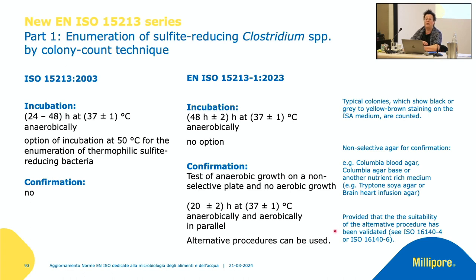It is now always written in the ISO standards that alternative procedures can be used, but they have to be validated according to the ISO 16140 series. Of course, but this is mentioned now.